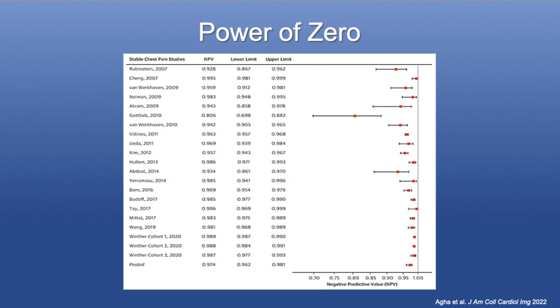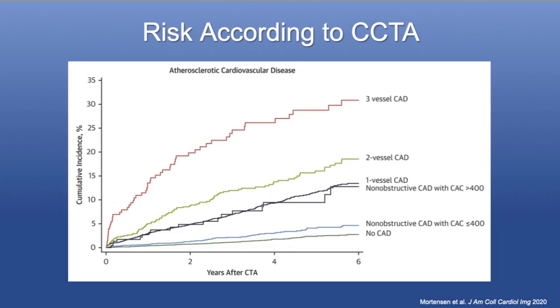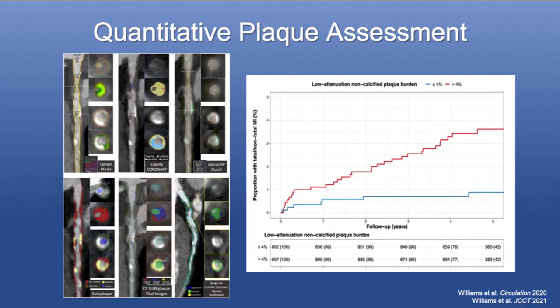recent meta-analysis. But we also know that a percentage of patients that have a calcium score of 0 can still have plaque. This is seen in about 16%, plus or minus, depending on the population, the age, and the risk factors of the patients. There's a percentage that we could be missing for therapy mostly. We know the chances that they will have obstructive disease is very low, but we also have the availability with CT, with contrast CCTA, to visualize plaque and, in that way, treat the patients appropriately.